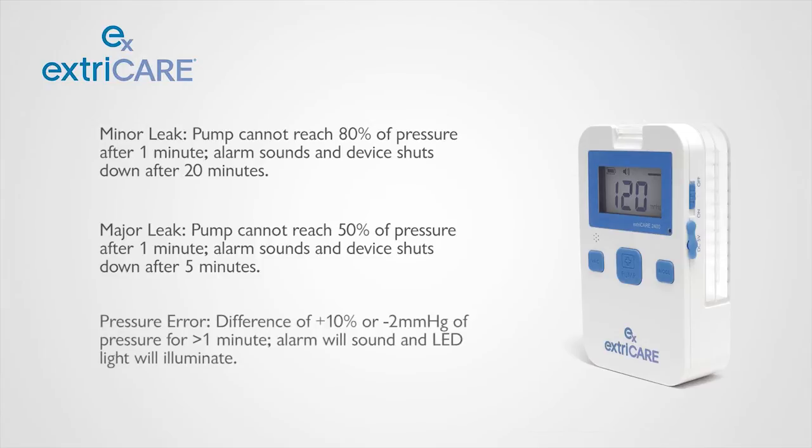For pressure errors, if there is a difference of plus 10% or minus 2 mmHg for more than 1 minute, an alarm will sound and the LED light will illuminate. This is a small leak, but the pump will continue to run.